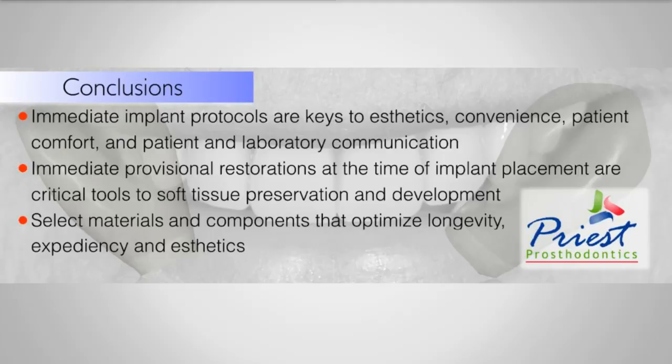Immediate implant protocols, they are keys to your aesthetics, convenience, your patient comfort. Patients love these things, by the way, and your patient-lab communication. These are critical tools at the time of immediate placement for either soft tissue preservation, as I showed you with Frank, the first patient, or soft tissue development, as you saw in Angela. And you want to select materials and components that optimize the longevity, expediency, and aesthetics. You know, knock on wood, I've not had a single, I'm talking about single crowns now, and I've done hundreds of these, but I haven't had a single one fracture. We've had implant failures where the whole thing comes out, but not one of them is fractured.